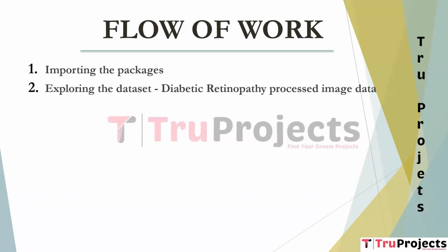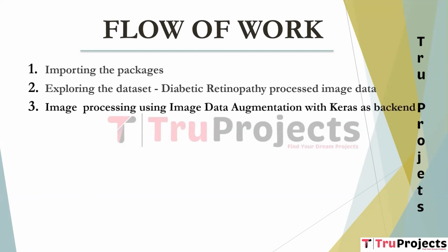Exploring the dataset. In this step, we investigate the dataset containing processed images related to diabetic retinopathy. This exploration helps us to understand the data structure, distribution, and characteristics, which are crucial for the subsequent analysis. Image processing using image data augmentation with Keras as a backend. This module involves employing Keras as a backend to perform image data augmentation. Data augmentation techniques are applied to the images to increase the diversity of the dataset and improve model generalization.